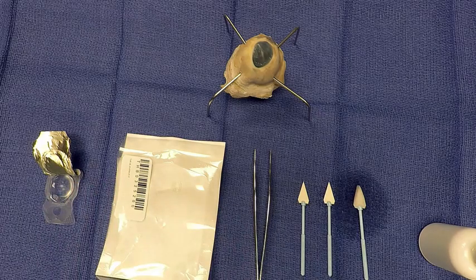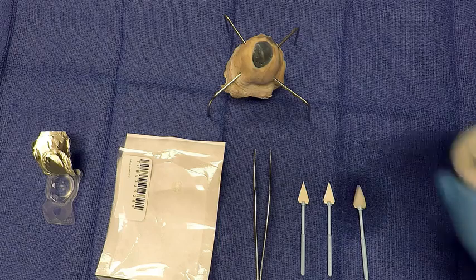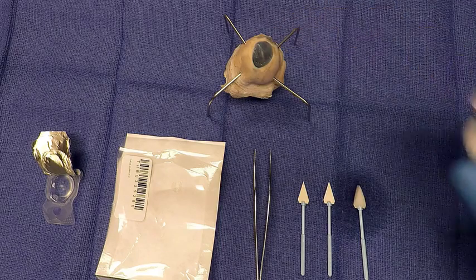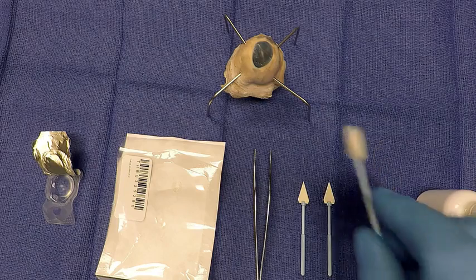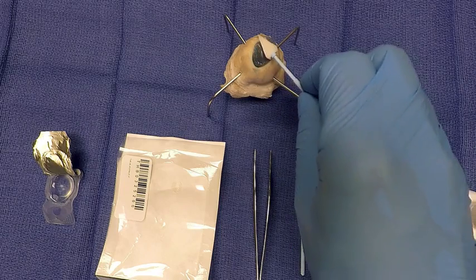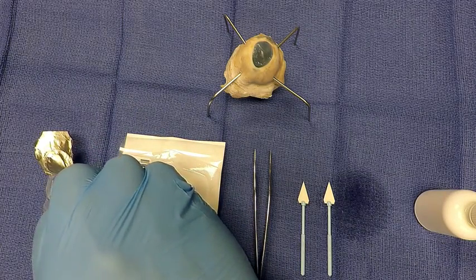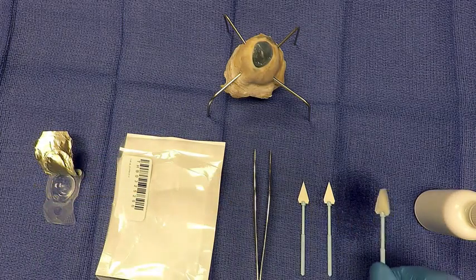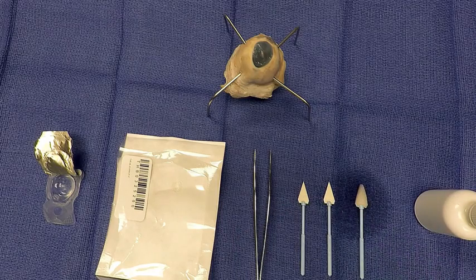First, depending on surgeon preference, a lid speculum can be used to hold the eye open, or the technician can hold it open manually while the procedure is being done. Apply the anesthetic drops after opening the eyelid. After applying the drops, have the technician or surgeon use the soft cell sponge to dry the ocular surface. Also have the technician dry out the bandage contact lens with the soft cell sponge. Both of these steps are extremely important as this will make the application of the membrane easier and will ensure adherence to the surgical site.